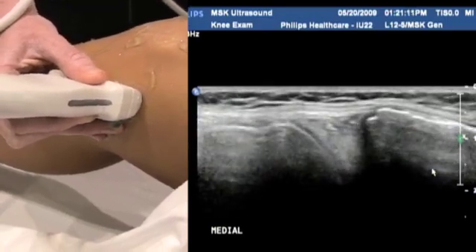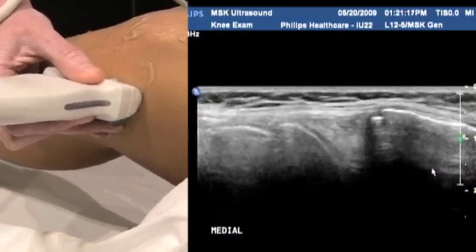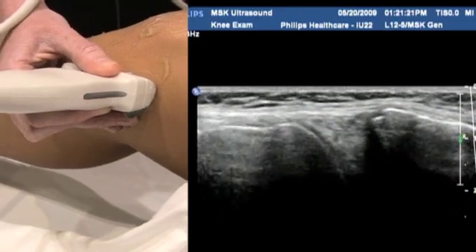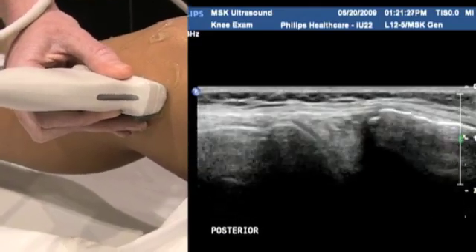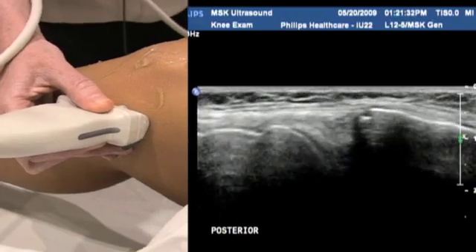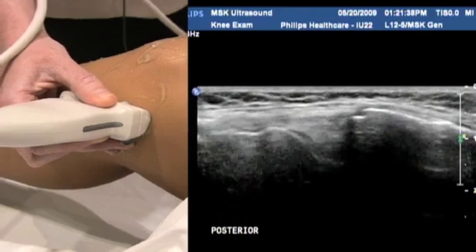They're the major components that we look for in the knee anteriorly. The other thing that we can do, depending on patient's symptoms and indications, is to look posteriorly in the knee. Most people, when they talk about musculoskeletal ultrasound, one of the first things that comes to mind is a Baker's cyst, and certainly that's something we're going to find posteriorly in the knee, in the popliteal fossa.